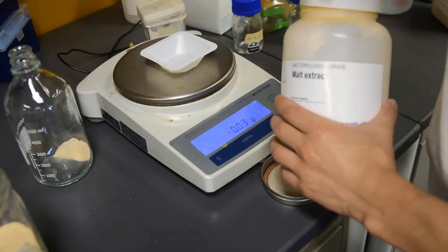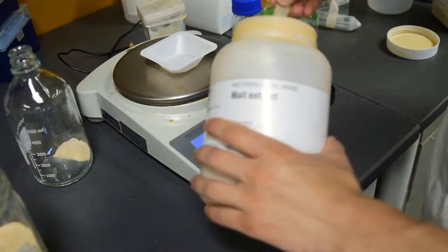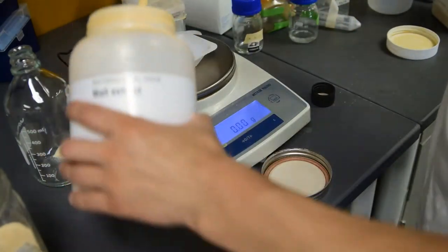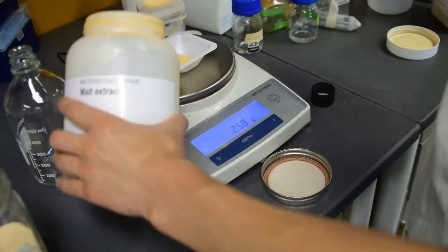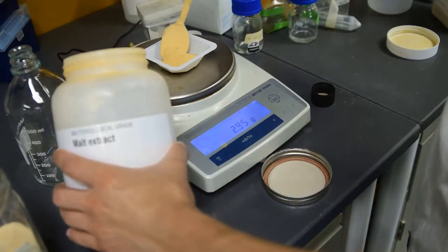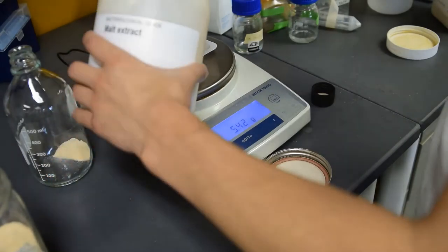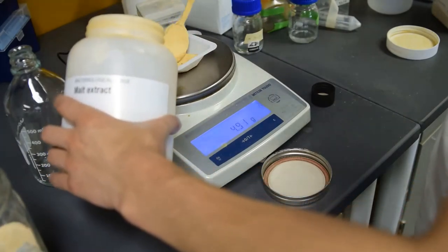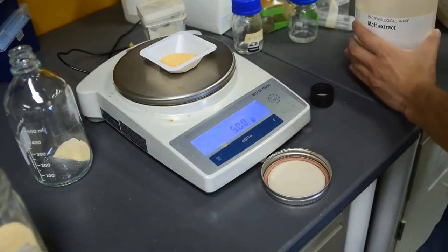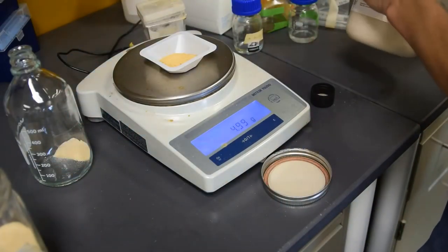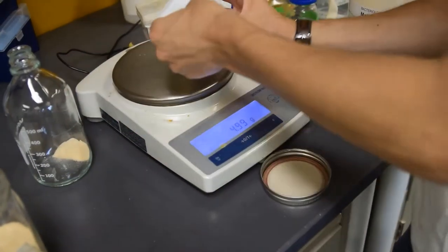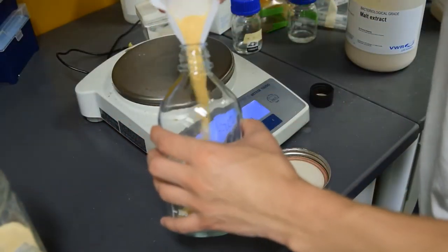Next we're going to do malt extract. Tare the scale again with the new weighing dish. Fill it up. Malt extract can be somewhat sticky, so make sure to wash your hands afterwards. Again, pour it into the container and throw your weighing dish away.